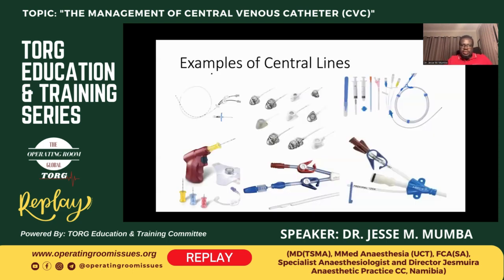Here are just a couple of examples. I know you're familiar with this type of central line because these are the ones that we mostly use. Then we have the dialysis catheters. These are also inserted, like I've said, and can be permanent or temporary. And then we've got the sheaths. The interesting part with the sheath is that it's got a very large bore where you can infuse even up to a liter in under 2 minutes.